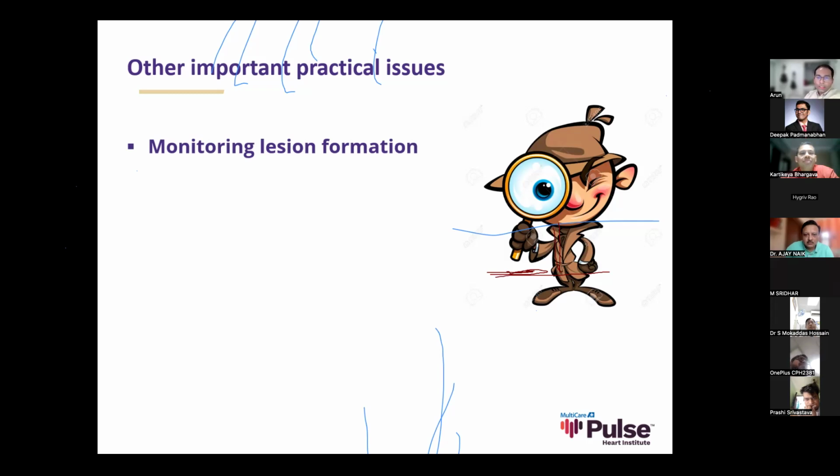So I think the simplest answer is that when you have a catheter and it is not ablating, it is still sending out electrical signals to measure all these parameters. The catheter is not completely inactive when it is sitting still and we are not delivering ablation. So the ablation catheter is always active. It's delivering small pulses of energy to measure the location, and it's also measuring impedance. That's just to absolutely simplify.